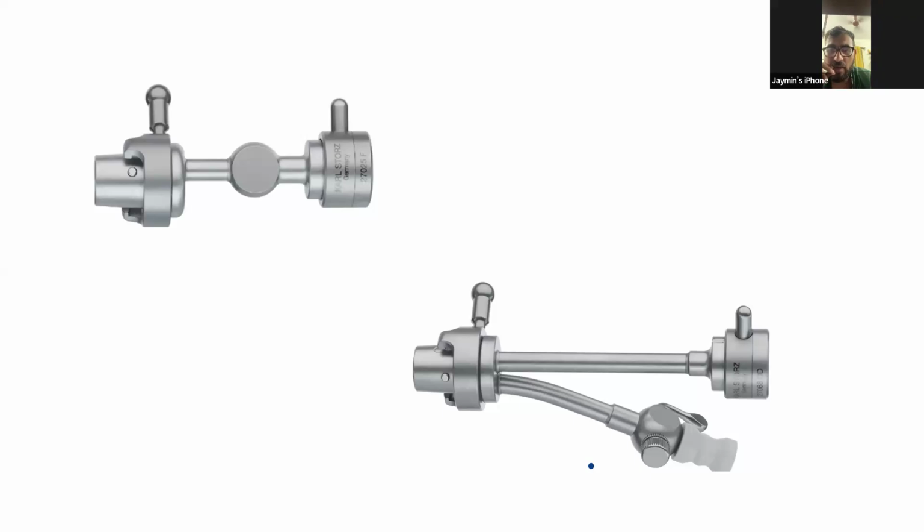Bridge, sir. The standard bridge length is 6 centimeters, again made of stainless steel, with mainly 3 parts: the knob which connects with the sheath, the telescope channel, the working channel, and the proximal knob through which the telescope enters.